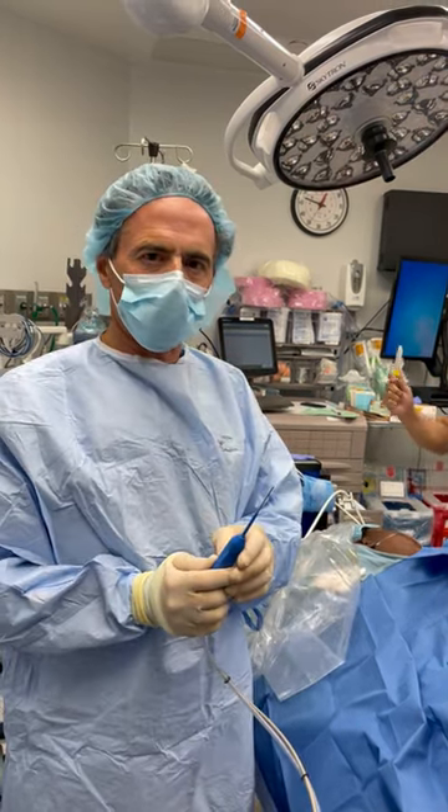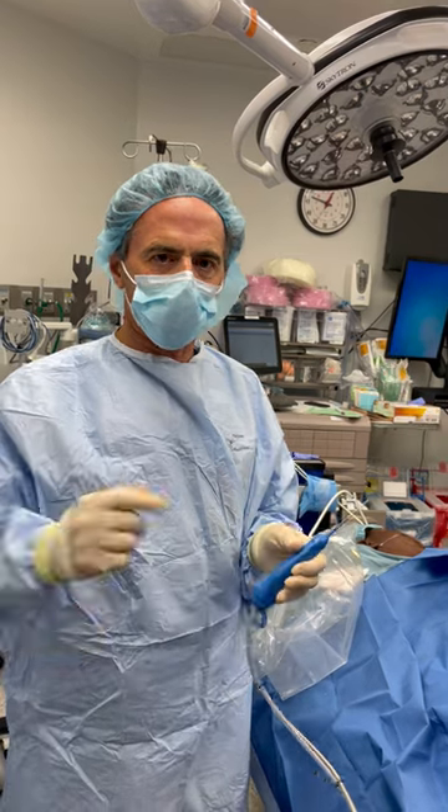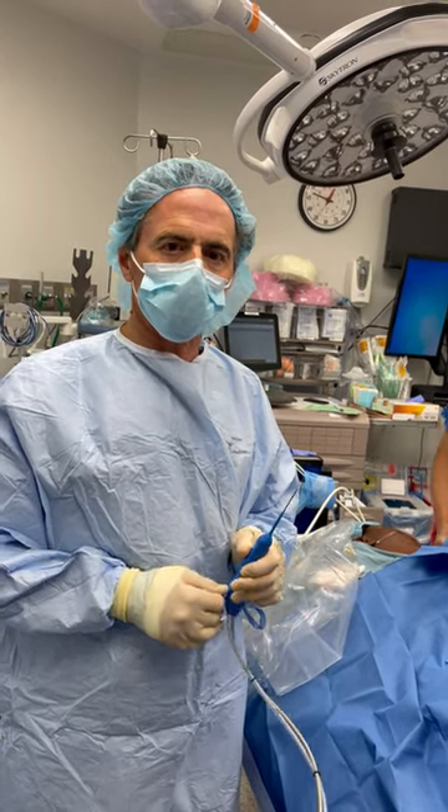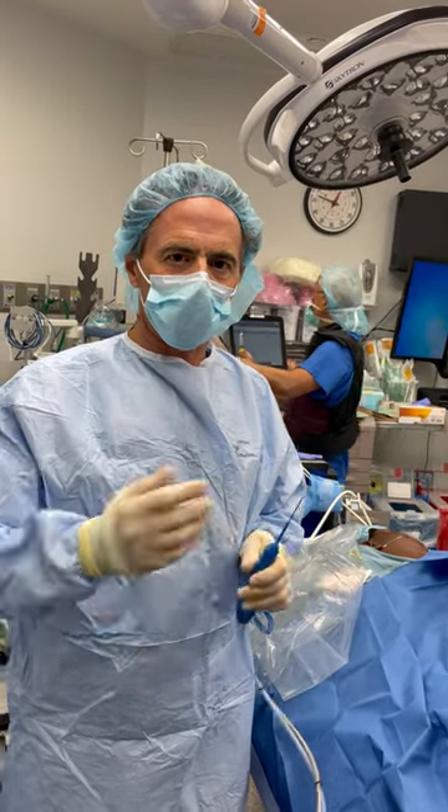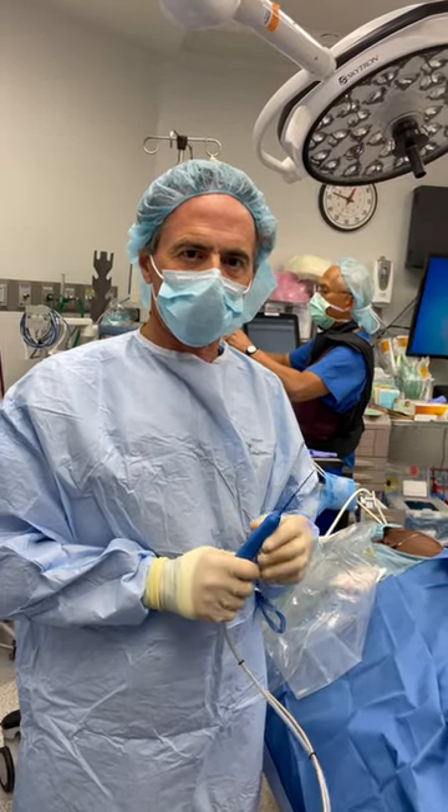It took a few minutes. We're all done and hopefully there'll be good healing with this. And sometimes we also use platelet-rich plasma to aid in it. We're very excited to offer this to patients with these conditions.